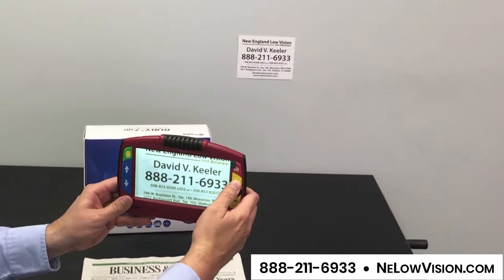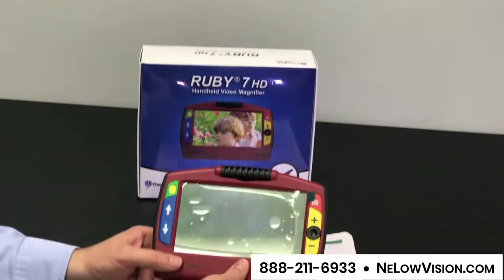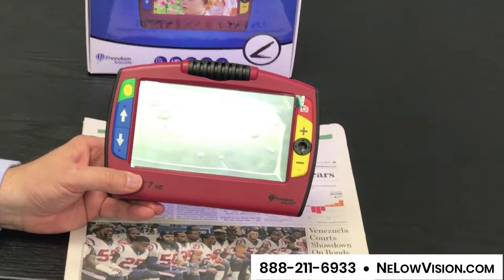In this case, we're just zooming in on my business card on the side. The device is portable. It has about three and a half hours of battery life depending on usage, and it has a built-in lithium ion battery.